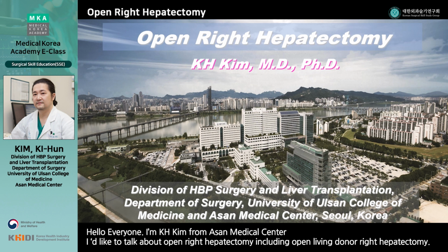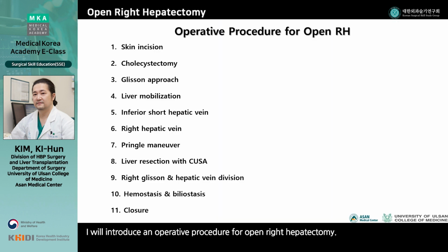I would like to talk about open right hepatectomy, including open living donor right hepatectomy. I will introduce an operative procedure for open right hepatectomy.